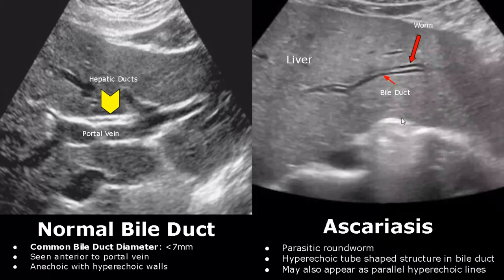Ascariasis is a type of roundworm infection. These parasitic worms can enter the bile ducts through the ampulla of Vater in the duodenum. The worm will appear as a tube-shaped structure in the bile duct or as parallel hyperechoic lines. If it is seen moving, that can be very helpful in diagnosis.